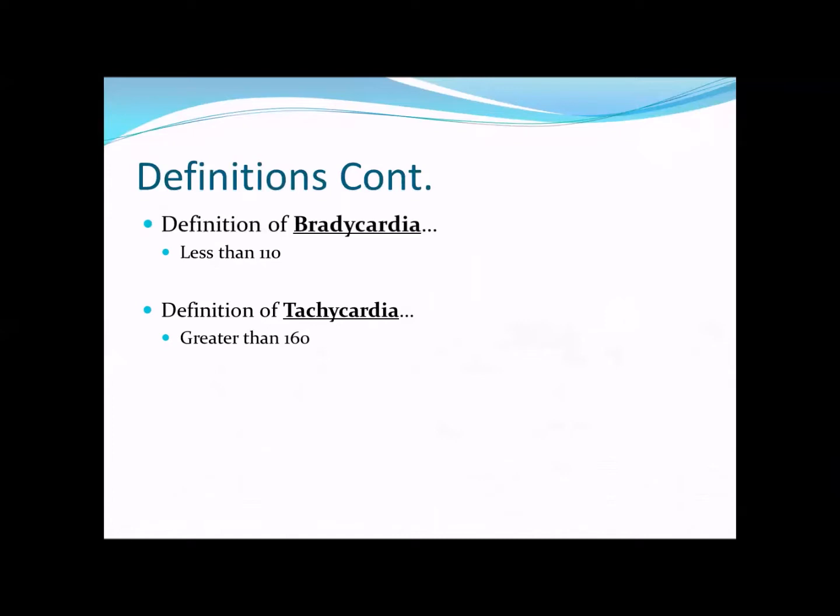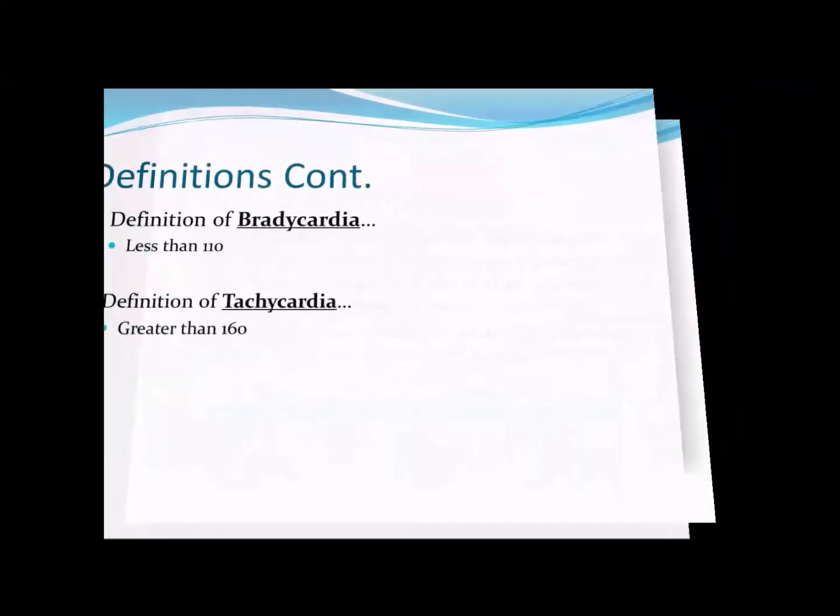But a lot of times, if the mom's water is broken and she's at risk of getting an infection, like chorio, mom's fever will go up, heart rate will go up. When mom has a maternal fever, we'll see babies tap along at 180s, and we don't like to do that for too long. So we really try to control mom's fever, because if we can get mom's fever down, we can see the heart rate come back down as well.